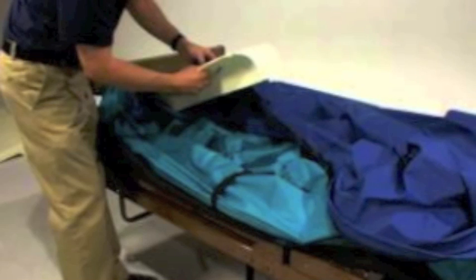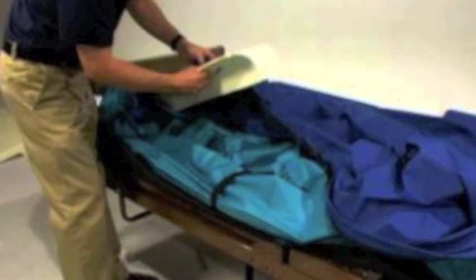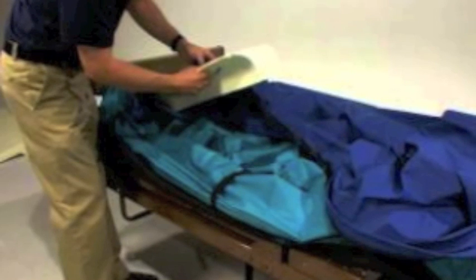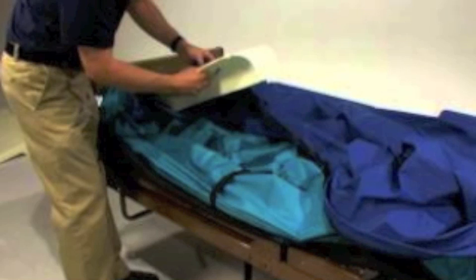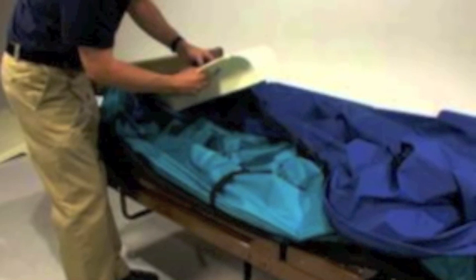Before placing the air mattress inside of the cover, ensure that the 4 bolster straps on the air mattress are secured by fastening the Velcro. Although the picture provided is blurry, you can see these straps on the sides of the mattress as an example. You can now place the air mattress inside of the protective cover on top of the mattress pad. This picture also accurately depicts what this step should look like.